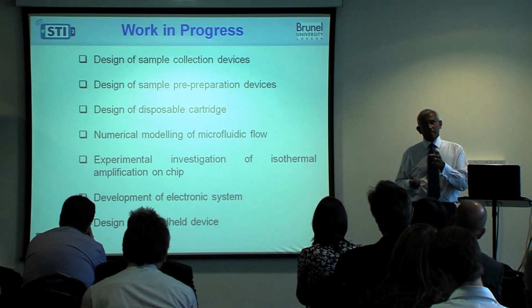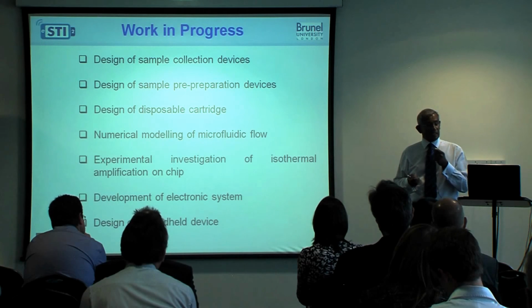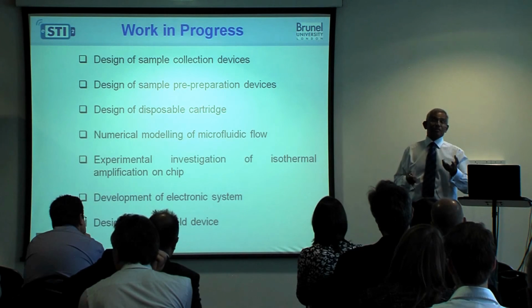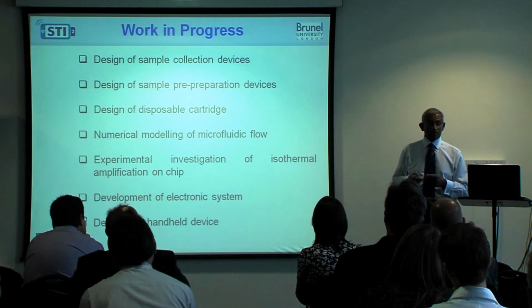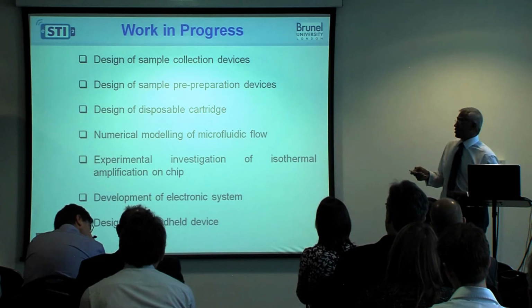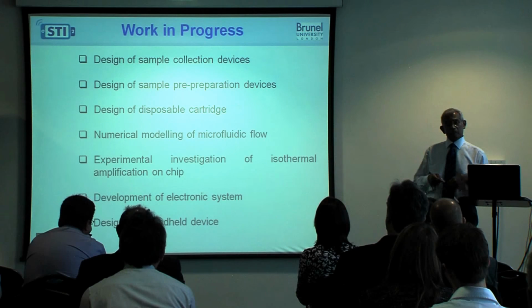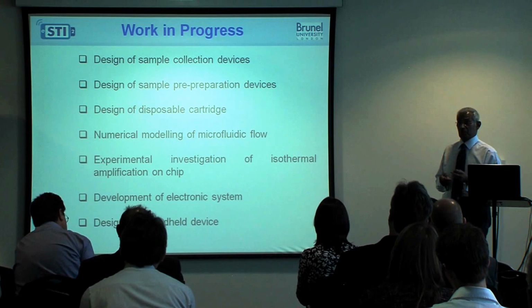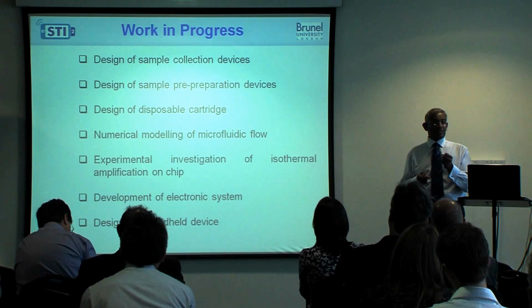For STI, you can either get the pathogens in urine or swabs. So urine is the most convenient form of collecting, and then to extract the pathogens from it, and then from that to extract the DNA, and then to characterize the DNA to see what sort of pathogens you've got in the urine. So this is a real challenge, and not a lot of work has gone on with urine, but there has been work with swabs. Urine is really a challenge because the amount of STI pathogens in urine is a very small amount. So extracting this is like a needle in a haystack.